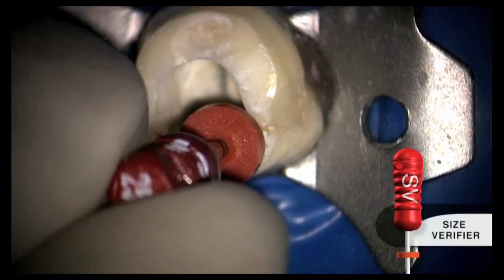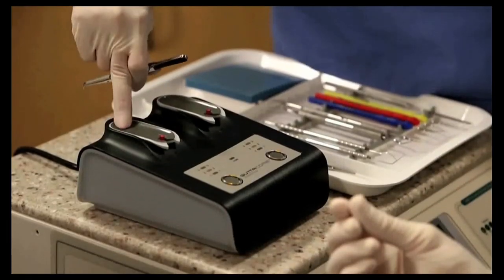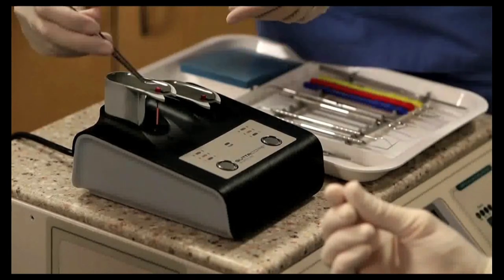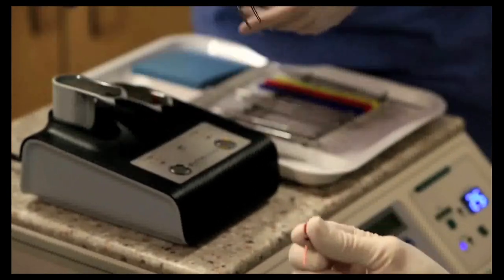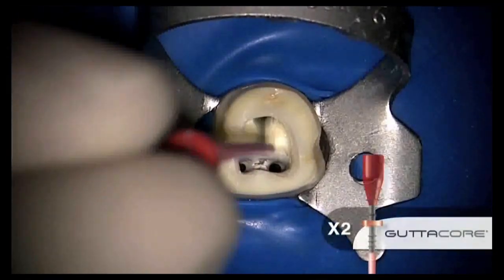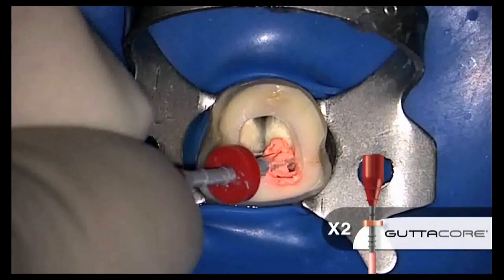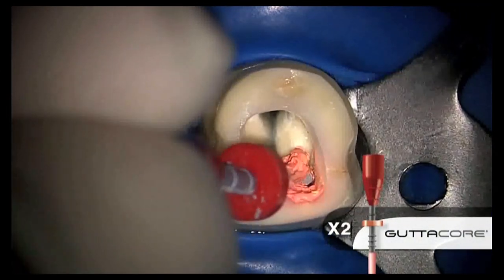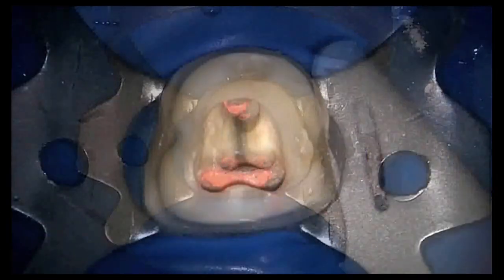As far as knowing if the shape is finished, again, when is it finished? When the verifier fits or when the cone fits. And in this instance, we're demonstrating the use of a carrier base, GuttaCore to be specific. And honestly, when you make great shapes, almost all techniques of obturation are going to be facilitated. Some are better than others. Some are more technique sensitive than others. That's another subject. It's not today's subject.